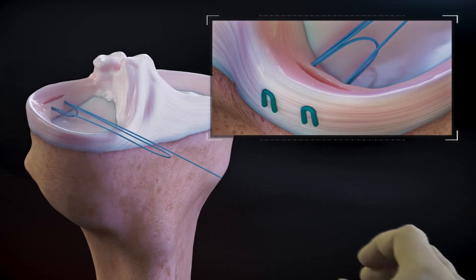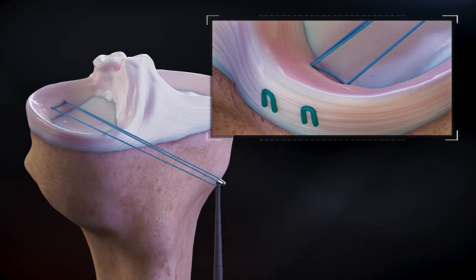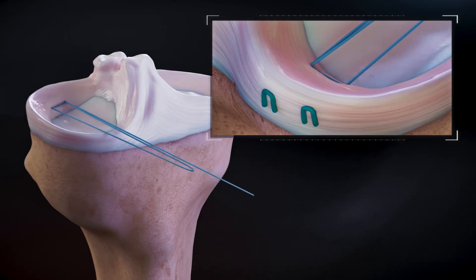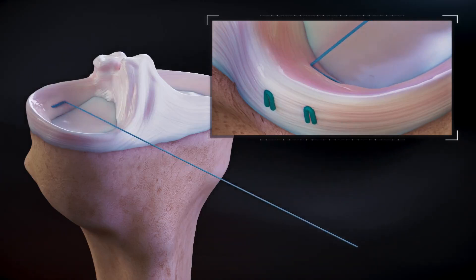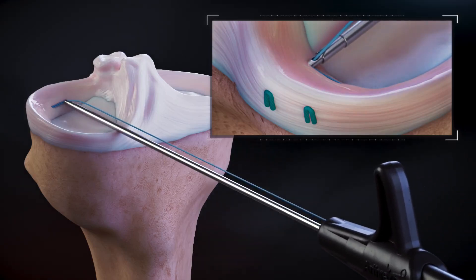Identify the suture loop. Use a probe or similar device to pull the loop suture to compress the suture anchors. Tighten the repair construct by pulling the single suture to reduce the tissue. Introduce a suture cutter to cut the suture at the tissue.